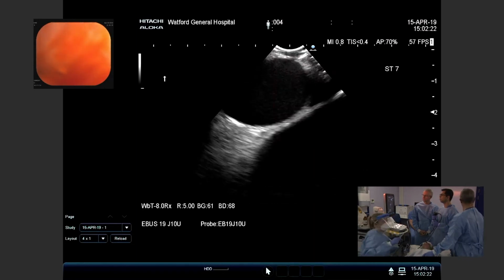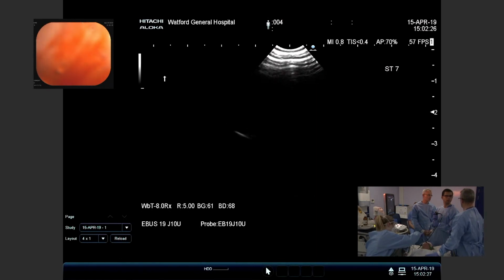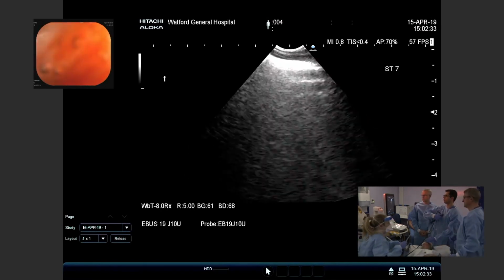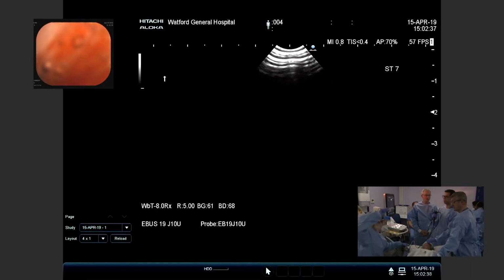Okay, maybe. Pass 2 adequate, mainly small lymphocytes, very occasional slightly enlarged cells, but I suspect macrophages. So if I was to categorise it, equivocal, probably benign. Okay. Thanks, Tony. That's on number 3. That was pass 2.